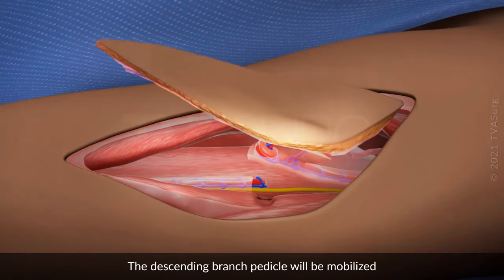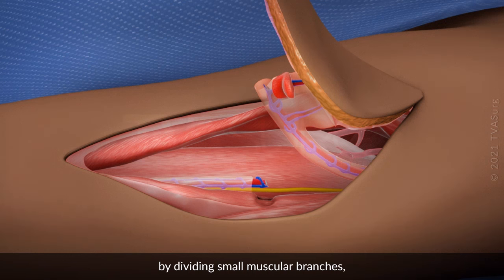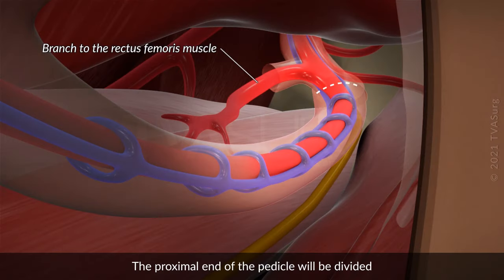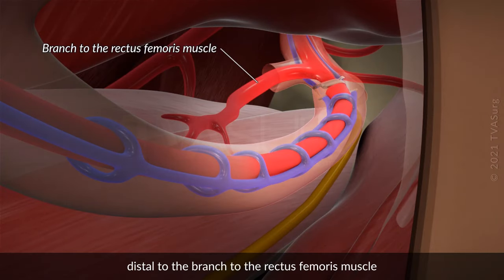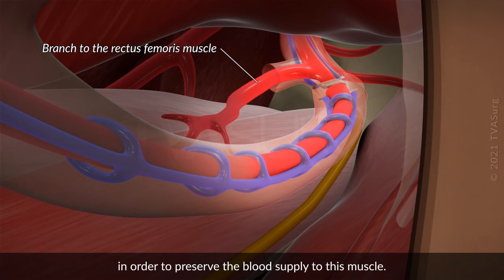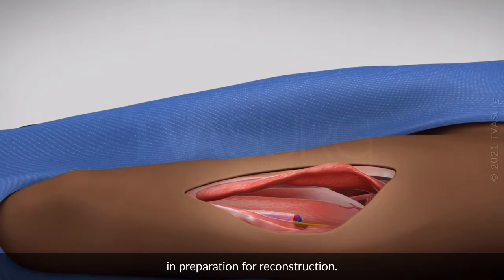The descending branch pedicle will be mobilized by dividing small muscular branches, and raised in a distal to proximal direction. The proximal end of the pedicle will be divided distal to the branch to the rectus femoris muscle, in order to preserve the blood supply to this muscle. The flap will be removed from the surgical field in preparation for reconstruction.